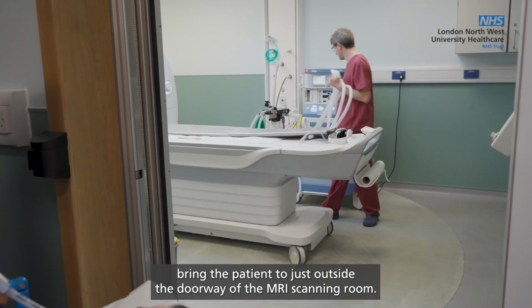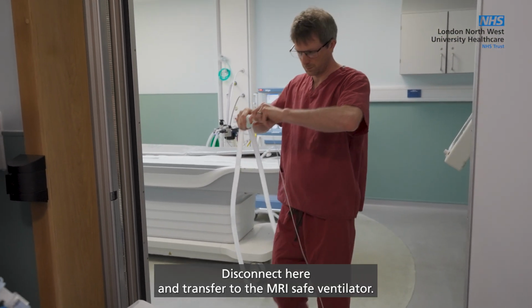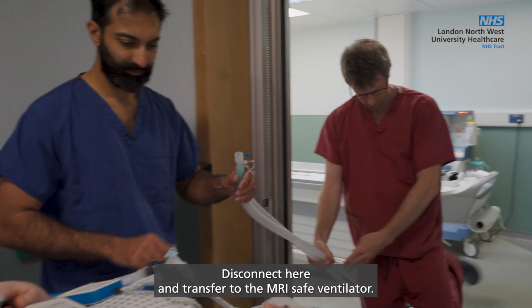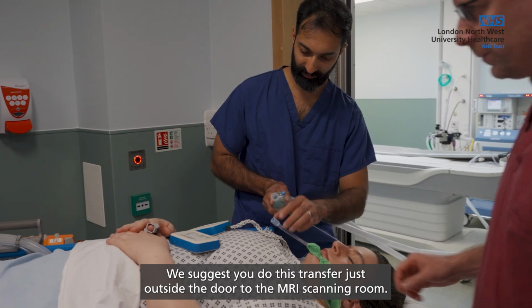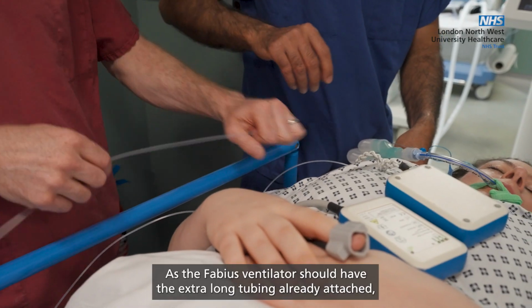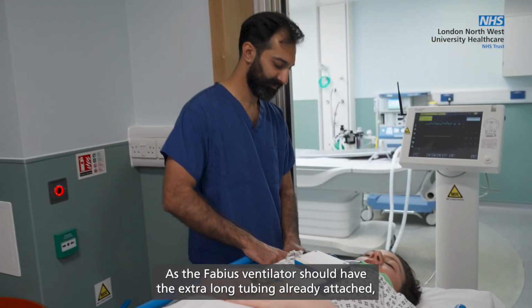In order to transfer your ventilated patients from the transport ventilator to the anesthetic machine, bring the patient to just outside the doorway of the MRI scanning room. Disconnect here and transfer to the MRI safe ventilator. We suggest you do this transfer just outside the door to the MRI scanning room, as the Fabius ventilator should have the extra long tubing already attached.